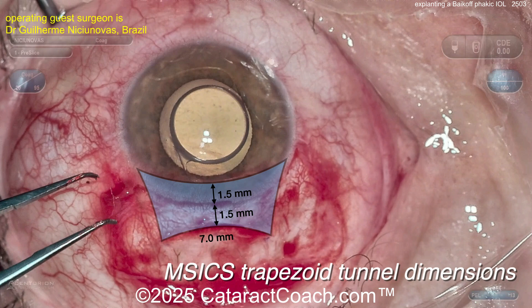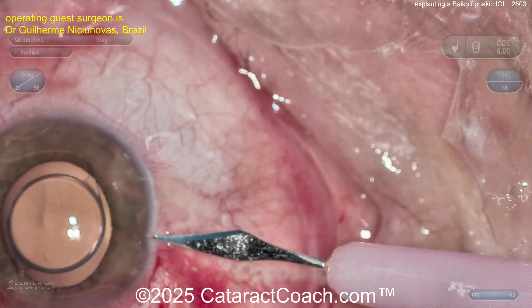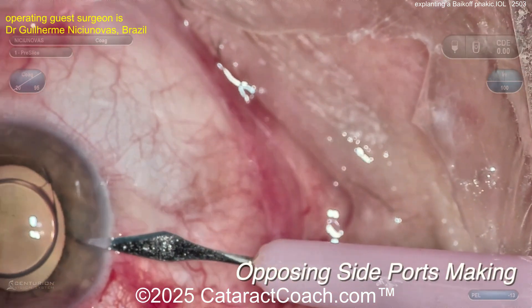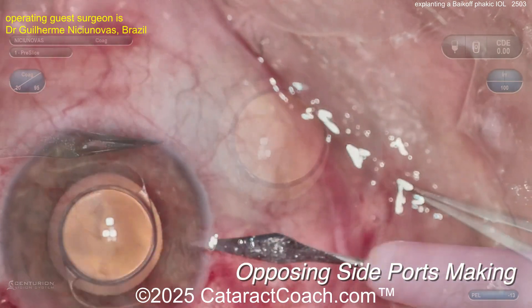This is a relatively soft nucleus, so it can come out very easily. If you had a very dense nucleus, you may need a little bit larger opening, a little wider. Here comes a paracentesis — there's one on one side, and then another on the other side.